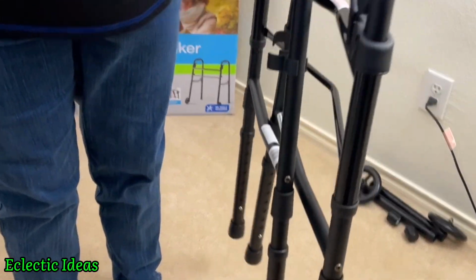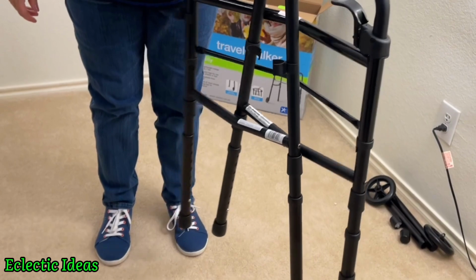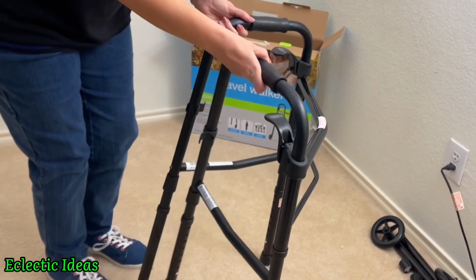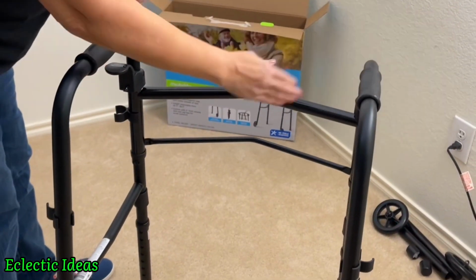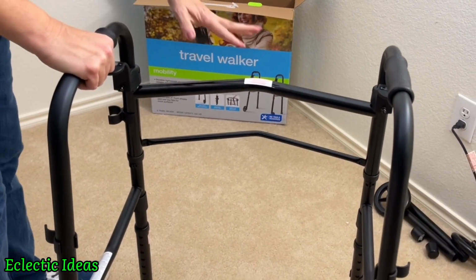And at 7 pounds, it's pretty light. And you can see it here from the side. Just be sure that when you do open it, those arms lock in place. That's important. You'll hear it click when it does it. When I turn it, this cross brace across the front is angled outward, and it gives you just a little bit more space inside, so that's a very nice feature.